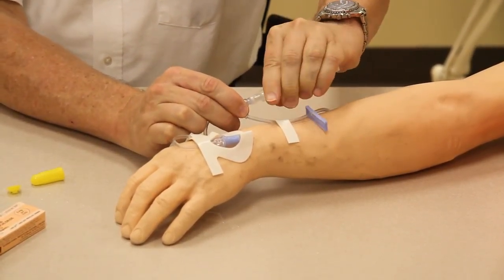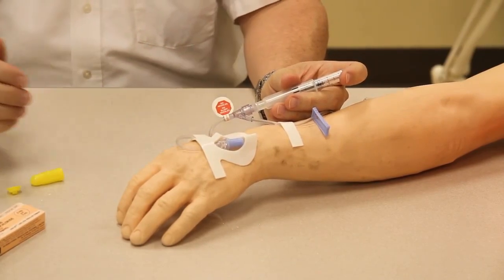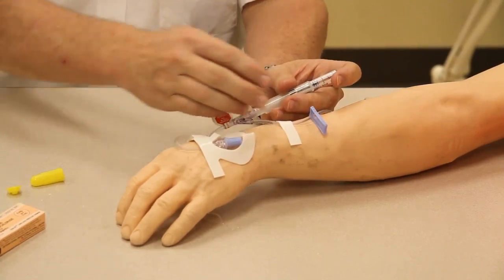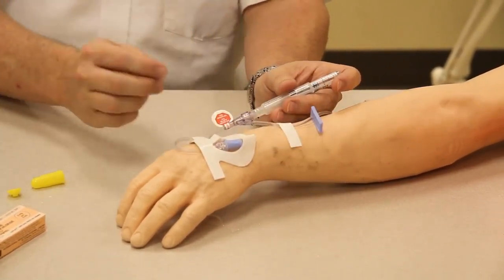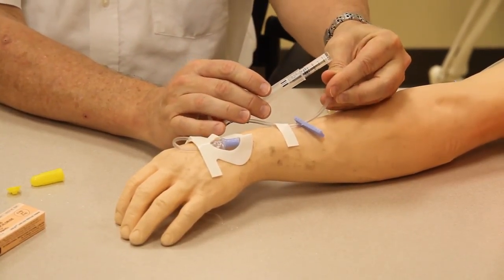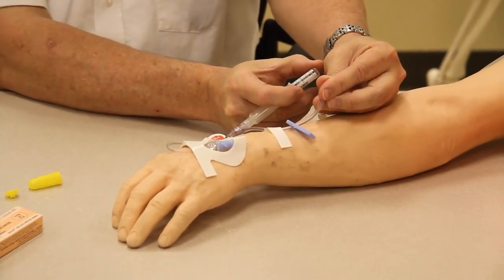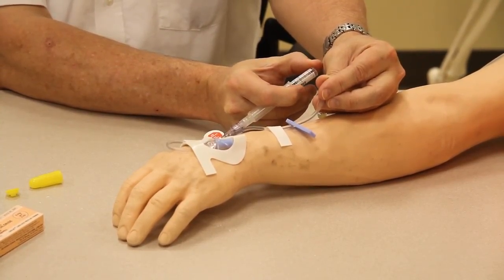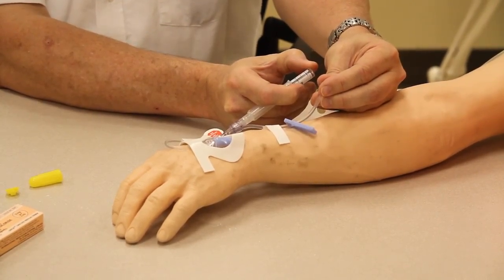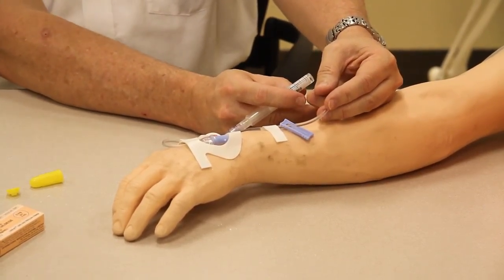Then I'm going to take an alcohol prep, clean off the end of the luer lock, press it in, twist, and then much in the same fashion as we did on the ampule, we're going to titrate the medication to the effect on our patient. We're going to clamp off, and you not only can clamp off, but if you would prefer, you can pinch off the IV solution, and that way it'll be easier to run solution in after you've given half a cc. We're going to give half a cc, run medication in, give another half a cc, run the medication in, and again we're going to titrate that to the effect of the respirations of our patient.